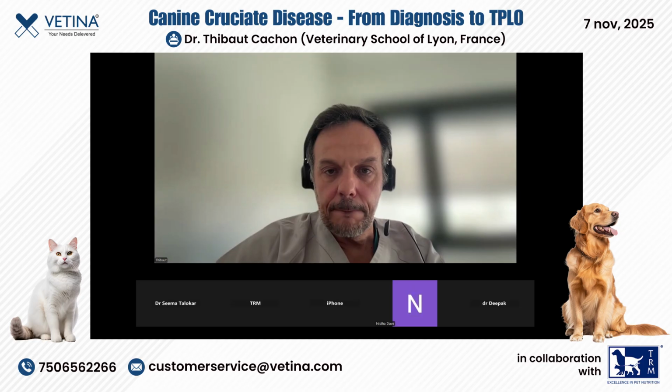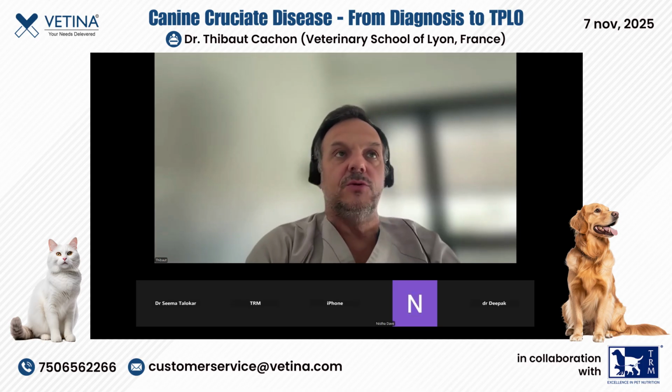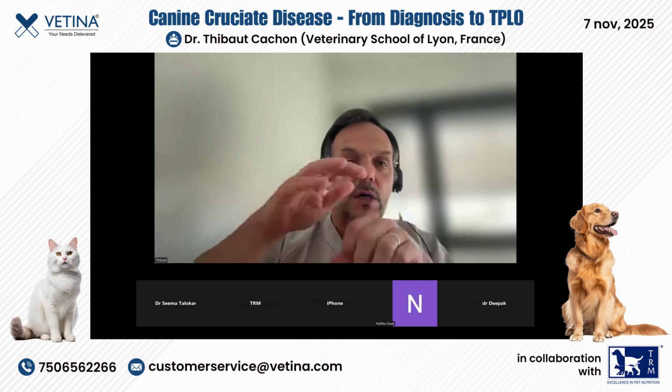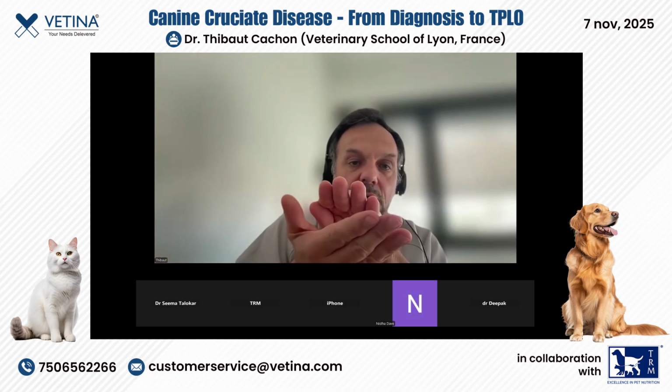Dr. Pranali has asked the question, with new implants and minimally invasive tools, where do you see TPLO evolving next? Okay. I think that the next thing that we are going to move for the TPLO is to take care of what we call pivot shift or internal rotation instability. Most of the time, we are moving to combine extracapsular suture with what we call the internal brace with the TPLO, because the TPLO is very nice to avoid any cranial displacement of the tibia, but it's not very good to avoid internal rotation.